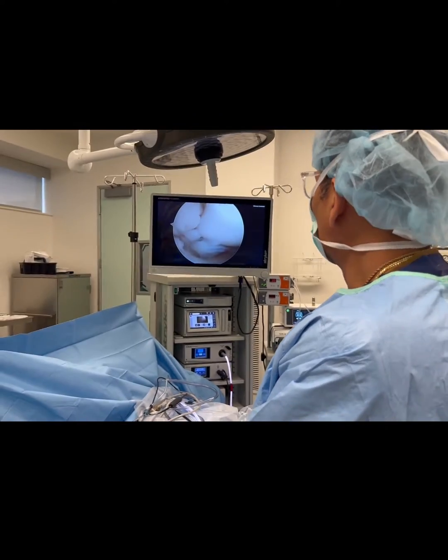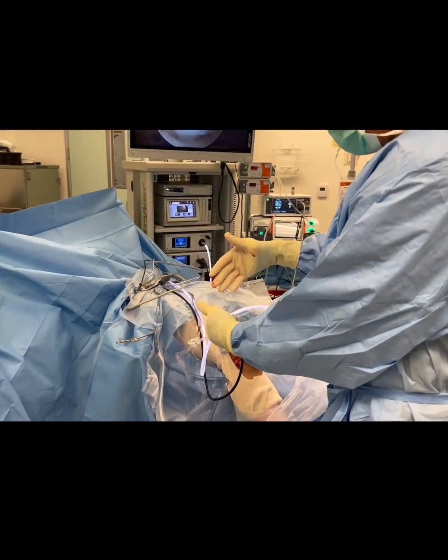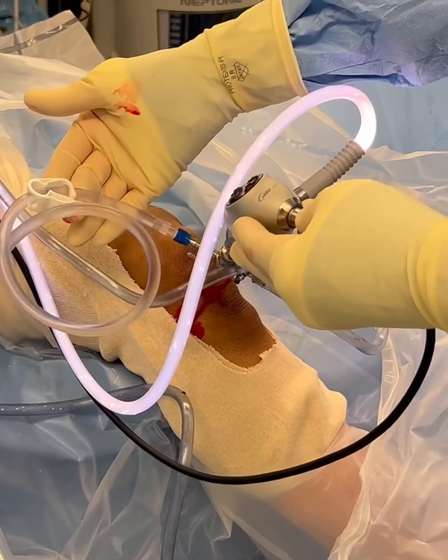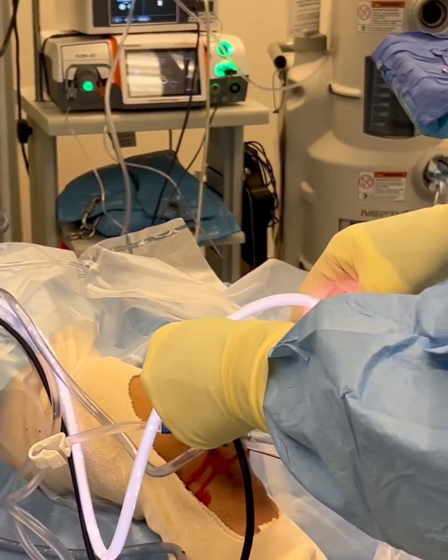Ladies and gentlemen, Dr. Mora here doing a right knee arthroscopy surgery. If you look down over here, you can see that my camera is inside the knee — it's a camera with a light cord. It shines the light inside the knee like a flashlight, and it pumps water into the knee to blow it up like a water balloon, so that we can look and explore throughout the knee.